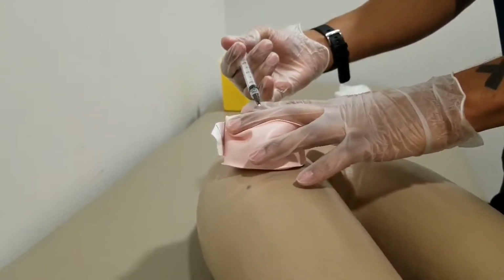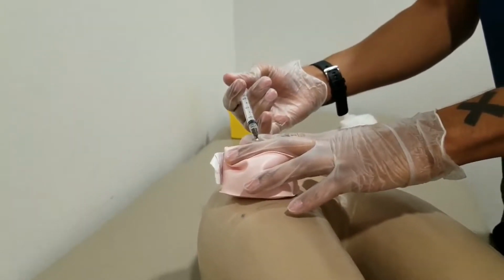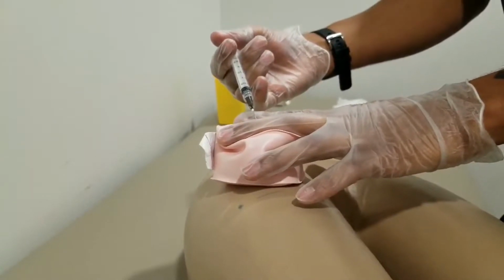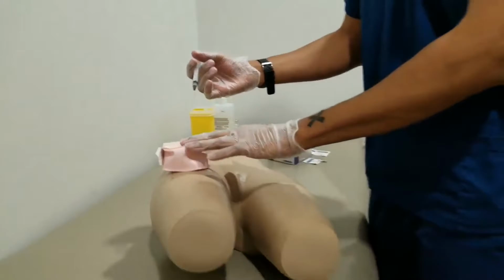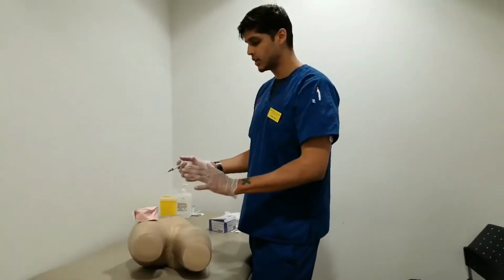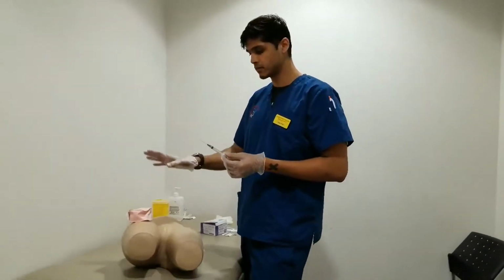I want to make sure I don't go too quickly because Mr. Mancini will feel pain and discomfort from that. Alright, the same way I went in, I want to remove it. And because this is a heparin injection, I don't want to rub the area afterwards to avoid any bruising and hematoma.